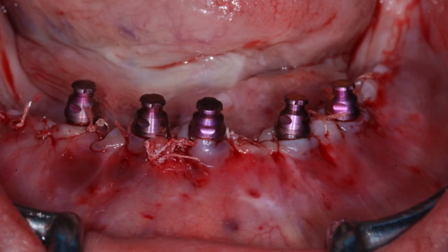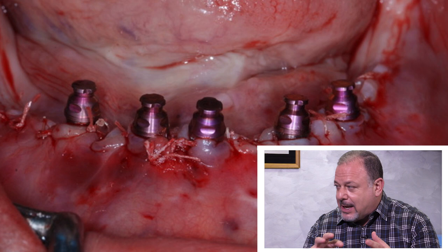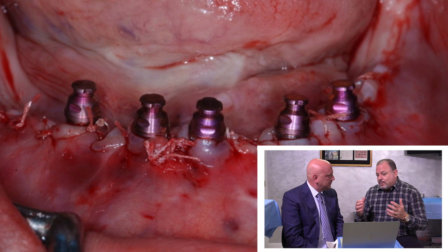So we need to go in and do a little work on that denture at this point. These are the denture housing caps sitting on top of the FTX abutments. The thing about the housing caps, which are really good, is that earlier we were talking about not having to do very much angling on those posterior implants. The housing caps allow us to rotate the housing cap so that we can make all of these implants parallel, which is what we would do the old way with multi-unit abutments, rotating and trying to get the hex. Here we're literally taking an instrument, holding it and rotating it where we want it to be, because we're going to pick these housing caps up into the denture.